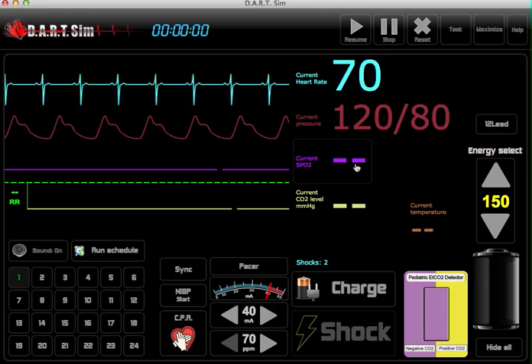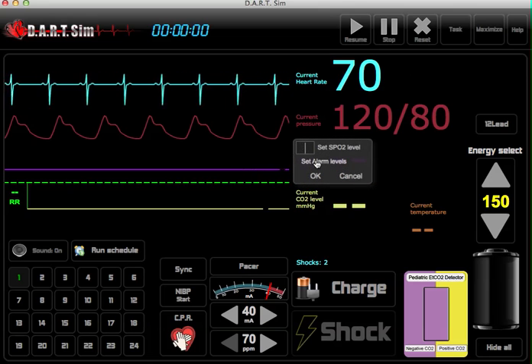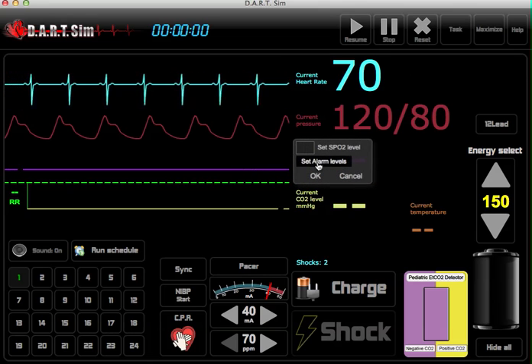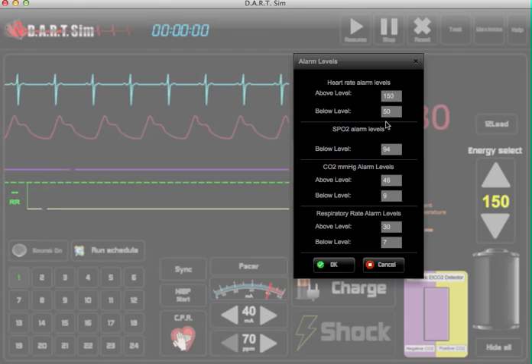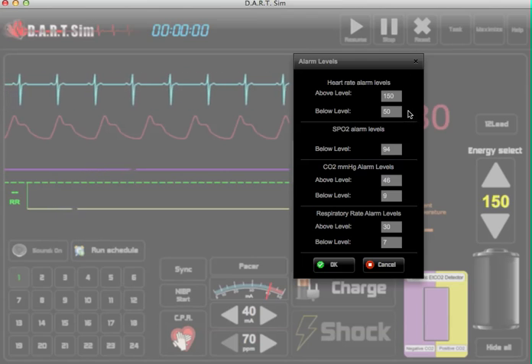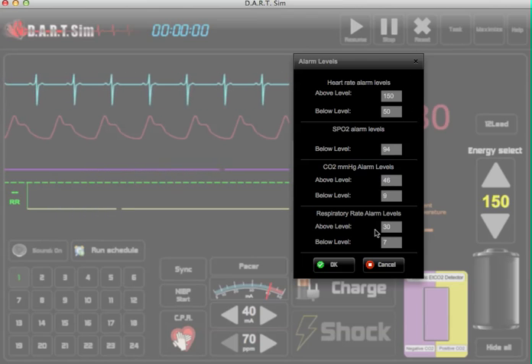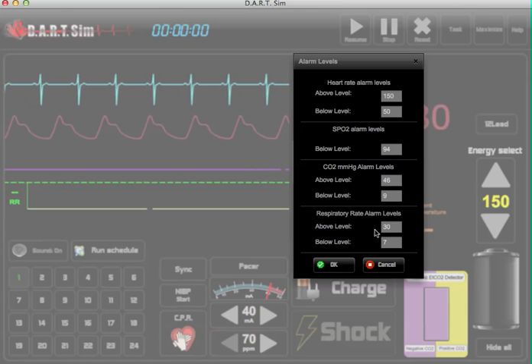You can also enter in SPO2, and also set custom alarm levels for heart rate, SPO2, CO2, and respiratory rate.